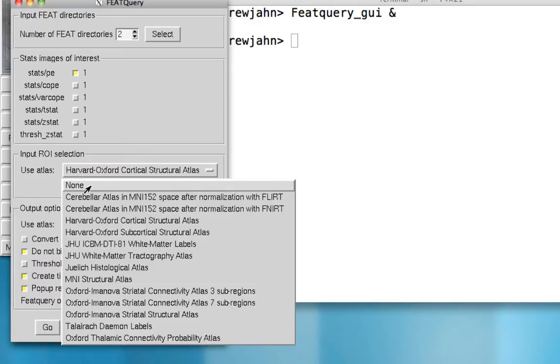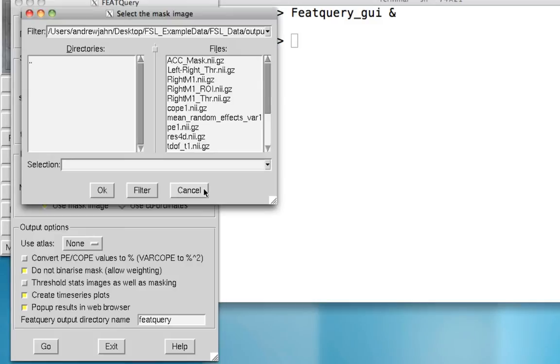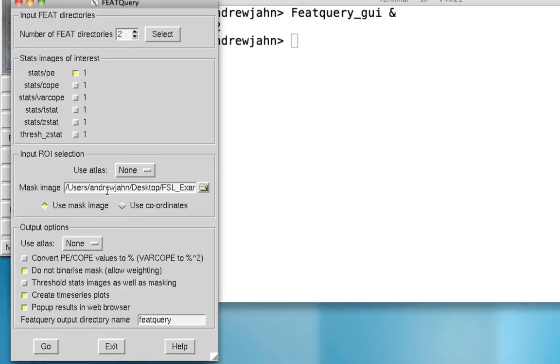However, if you've created your own ROI, such as the one we did from our contrast, go ahead, select none, and then select your mask image from the ROI that you created. In this case, our final one was RightM1_ROI.